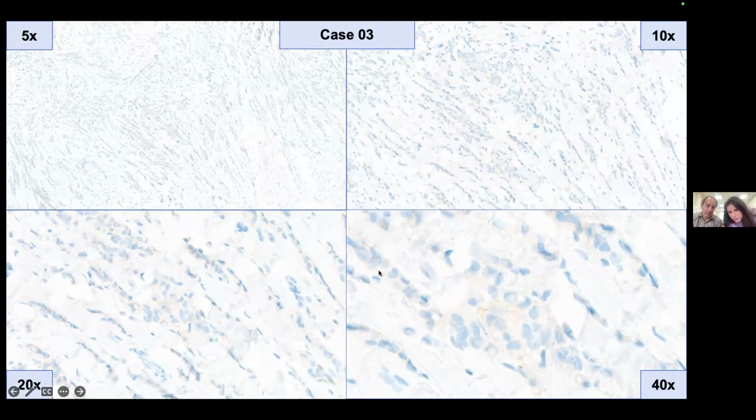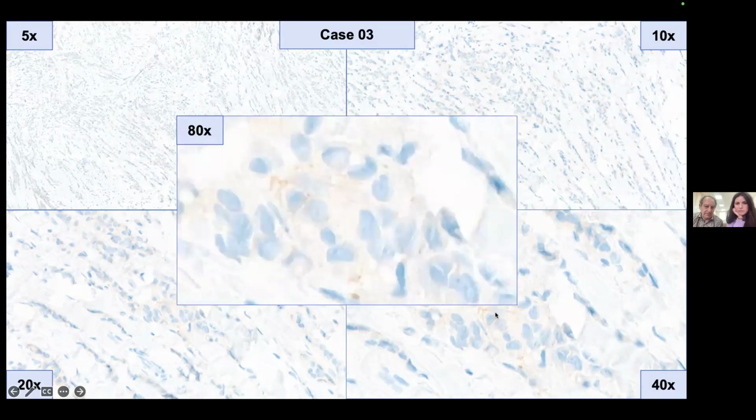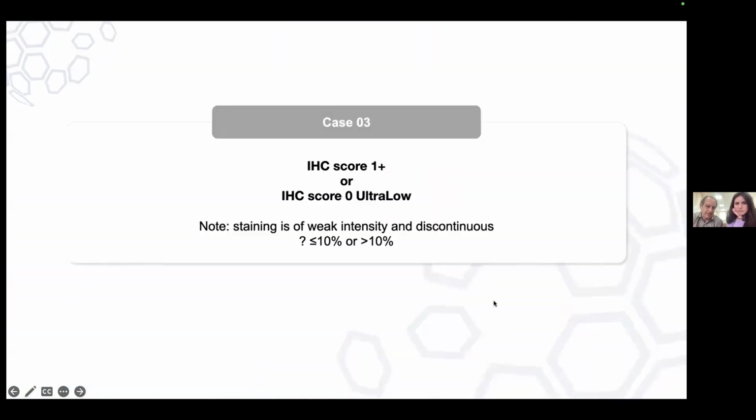Who knows, because maybe it's less than 10%. We don't know. We are hovering; it depends on quantities now. But if you don't think this is membrane staining, this becomes null. Maybe it's between these two. Shall we see what we diagnosed originally on this case? I think this probably is membrane staining. We think it is in between. It depends on how many cells you can count on these things.